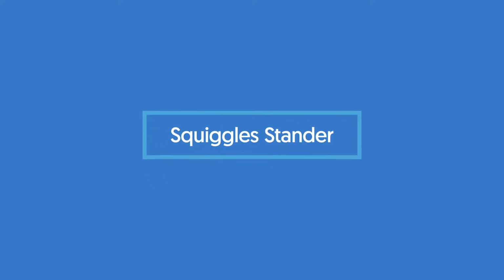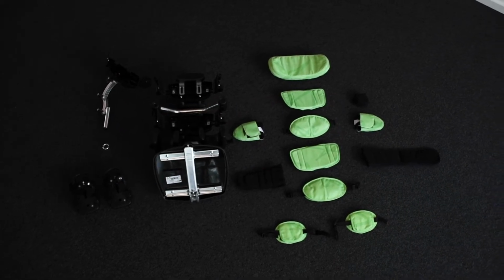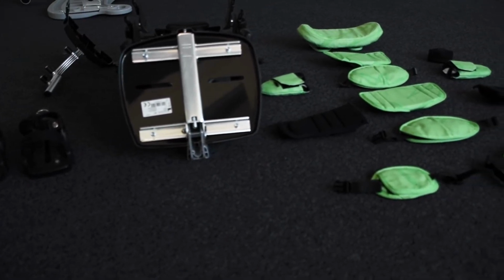Squiggles Stander instructional video. How to unpack and assemble the Squiggles Stander. What's in the box? All parts will be contained in polythene bags, with each one clearly labelled. Carefully remove them from the boxes and check you have all the parts you have ordered.